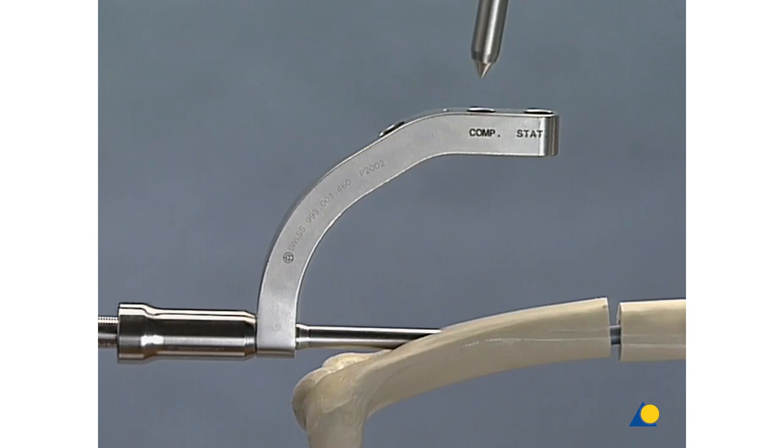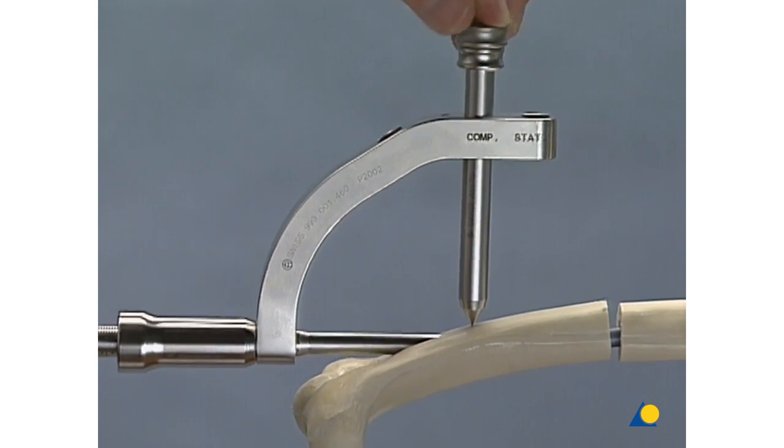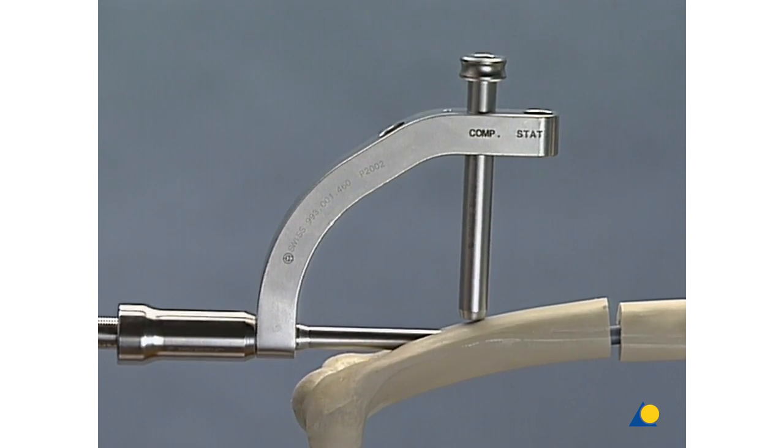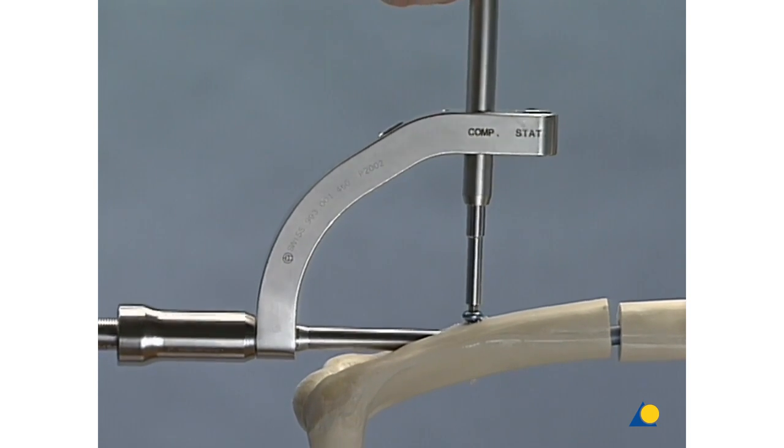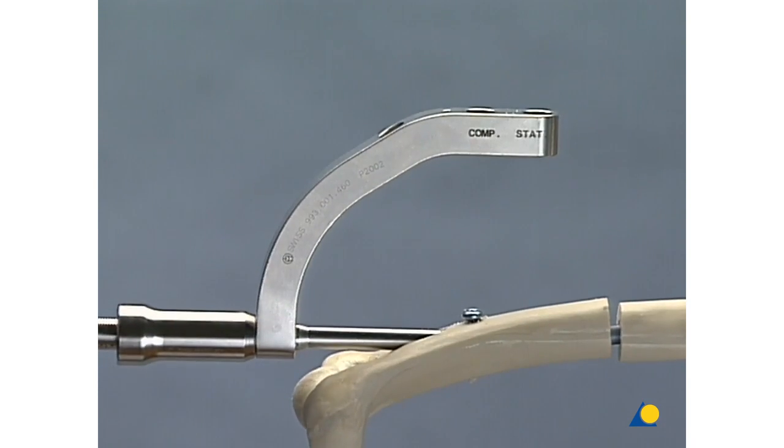Now, insert a distal locking bolt through the compression locking hole. Be sure that both locking bolts have a good hold in the near and far cortex. Appropriate nail length is important to achieve this.